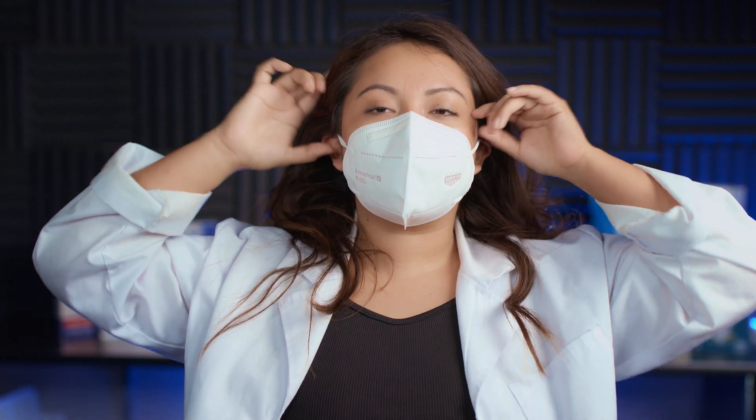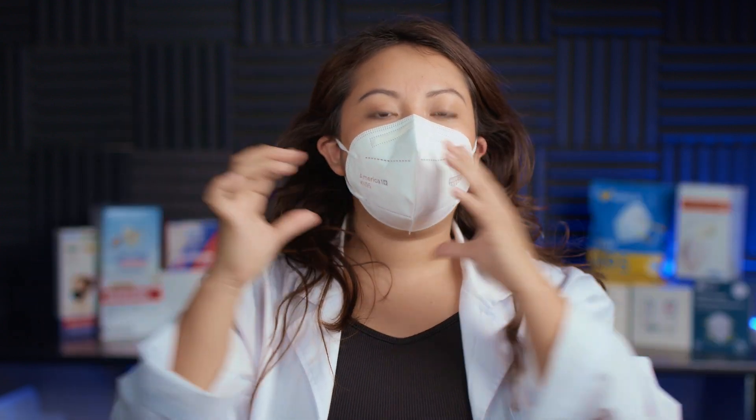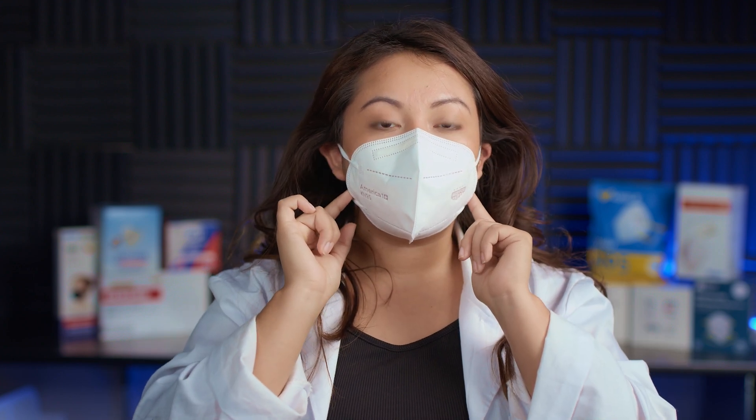I feel like my ears are getting pushed to the front a little bit. Everywhere else I am getting a good seal, other than at the nose area where I am getting a lot of leakage because of the nose wire.